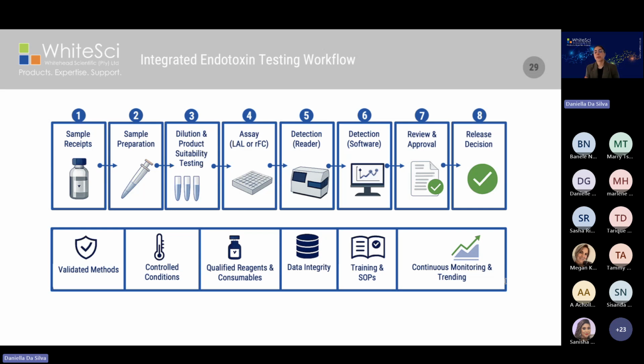So when laboratories experience challenge, the root cause often lies at the interface between these workflow components rather than just at a single step. This is why integrated approaches become increasingly valuable. By viewing endotoxin testing as a complete workflow rather than just a standalone assay, laboratories can often achieve greater consistency, efficiency, and confidence within their results.